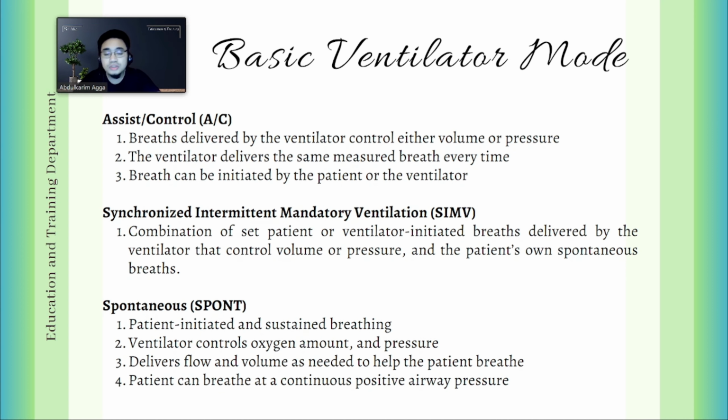But when we talk about your SIMV mode, the ventilator goes together, synchronized with the spontaneous breaths of your patient. Again, in AC mode, the one mainly in charge of breathing is the ventilator. For SIMV, it is a 50-50 scheme, wherein the ventilator is synchronized with the spontaneous breaths of your patient.